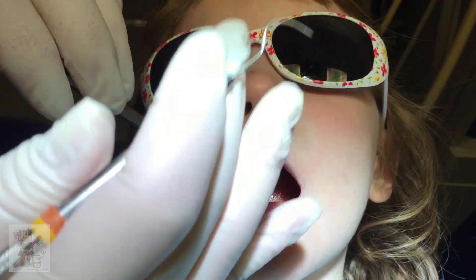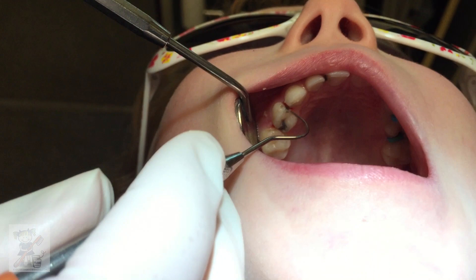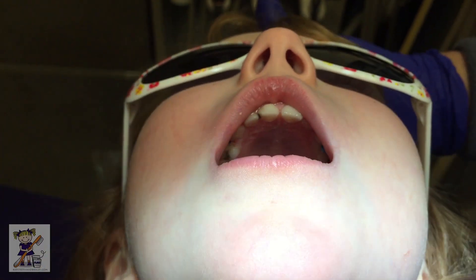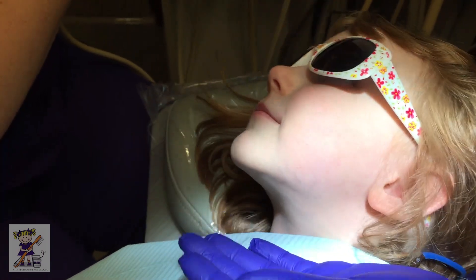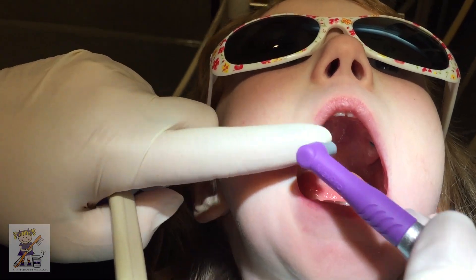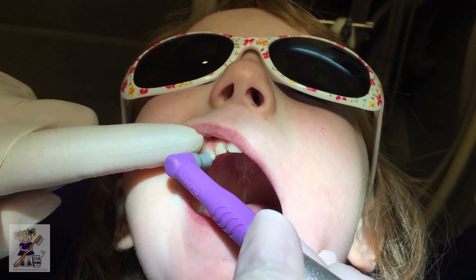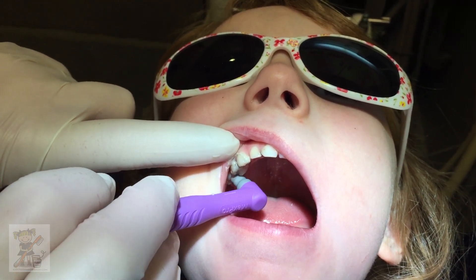Okay, can you open really big and look up high? Look at that — perfect. It made some space between your teeth. Perfect. Oh, you're so good. Ready? We're going to brush your teeth — get all the little snackies off of there. I have my purple toothbrush. Open big. Let's brush. Good job. Make sure there's no snacks hiding in there.